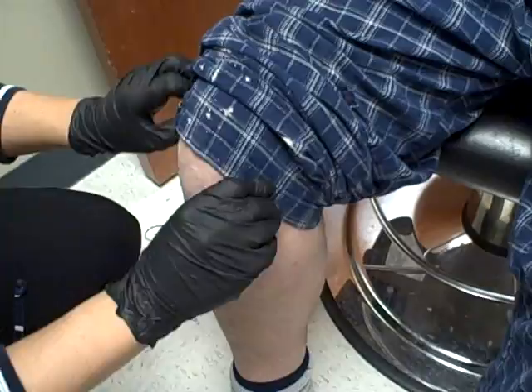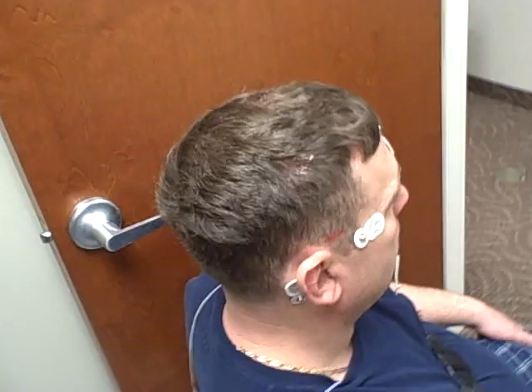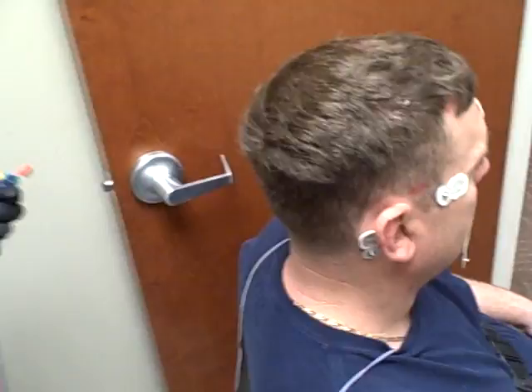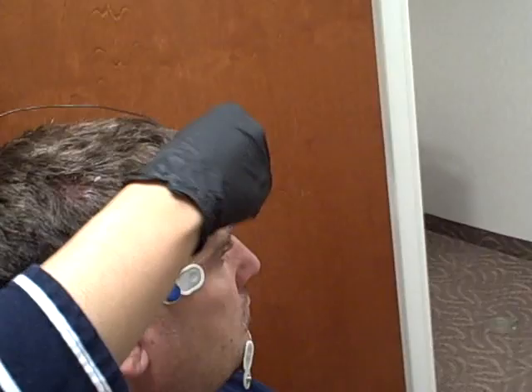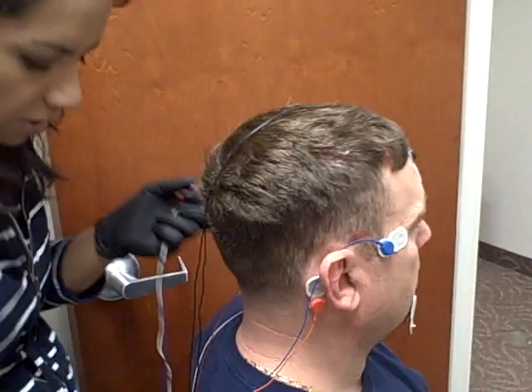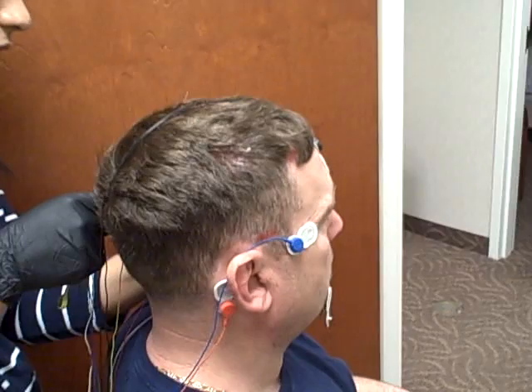When you're attaching, you can see there's actually slack here. So when the patient bends their legs in the middle of the night, those leads will not snap off. People sometimes develop a color code system — it's very helpful because when you have a failure with one of the wires, it's easier to trace it back once it's plugged into the head blocks.